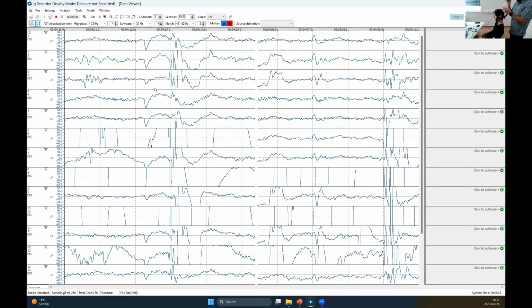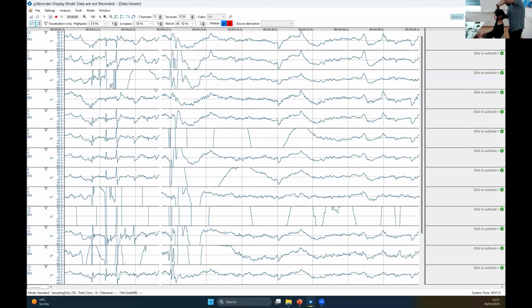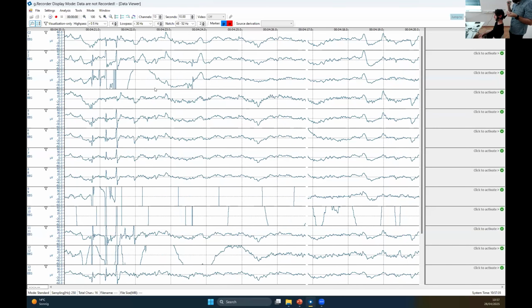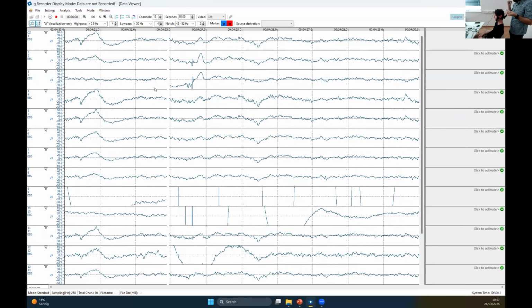You can see already them coming back. This is channel number 10. They are number-rated here, so we can apply a bit more gel if we find it necessary. So you can see already 10 is good. Let's see if he comes back. The filters are applying, so it takes a bit of time.